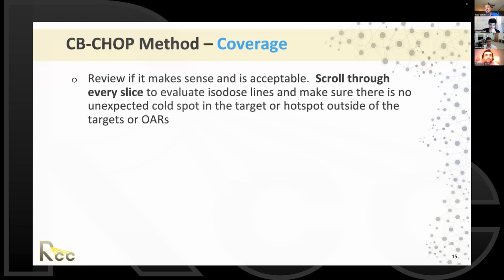Actually, the ropes are a technique not to avoid the shoulder, it's just to make the shoulders more stable. So they will always be in the same position, but you will always have targets in the way if you look at the patient's entry through the shoulder.